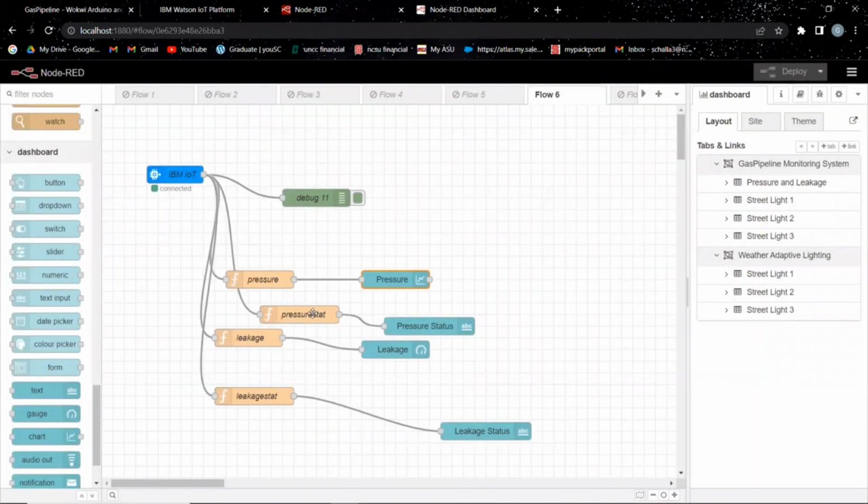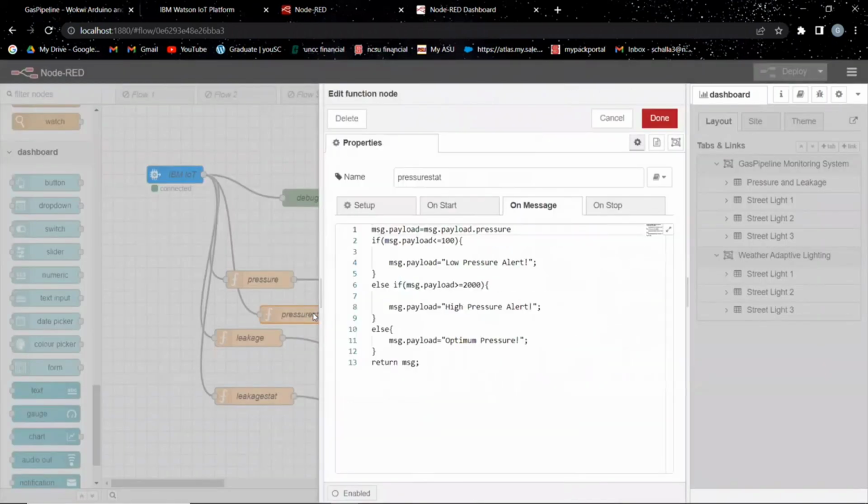And then coming to the pressure status, here we show the alert messages. So double click on the function. So this is made up of a series of conditional loops. So if the pressure value is less than 100, that means they have low pressure. And if it's greater than 2000, then a high pressure alert is given. Or else the pressure is optimum. So you have to define it like this and then click on done.